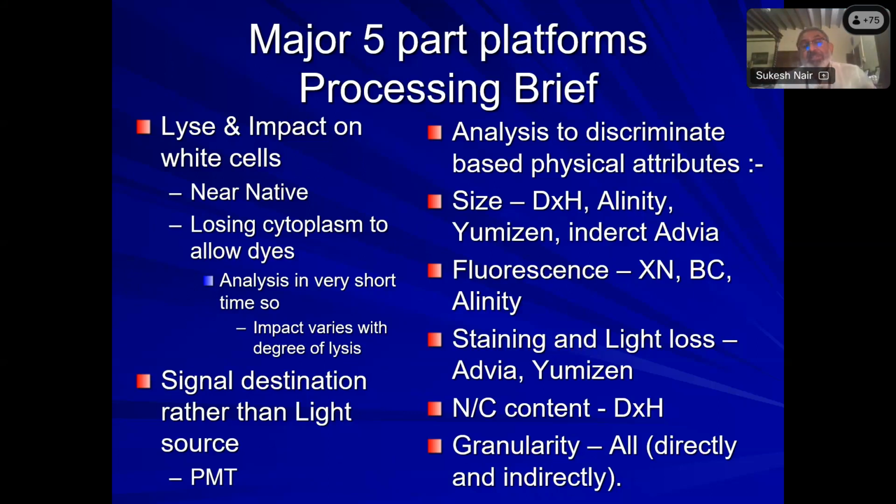Fluorescence: the only cell counters which use fluorescence are basically the Sysmex and the Mindray. But in addition, Alinity also uses fluorescence to differentiate between cells. Basically, the fluorescence is a nuclear dye.